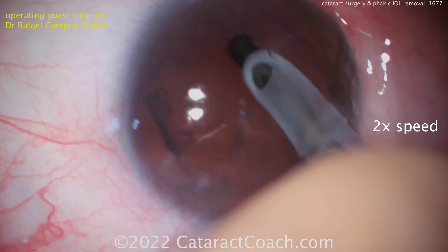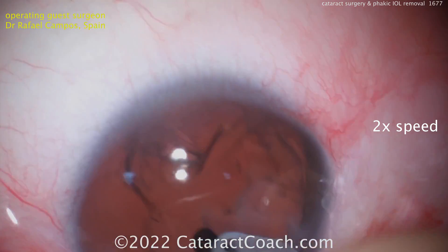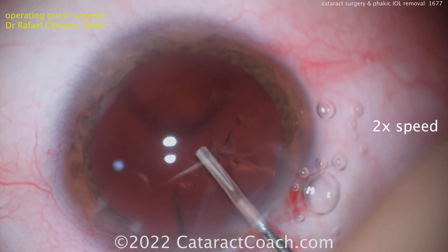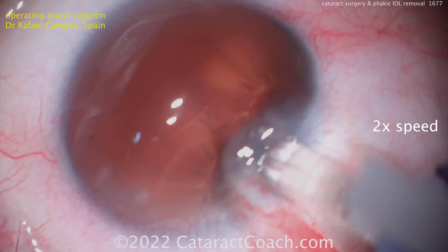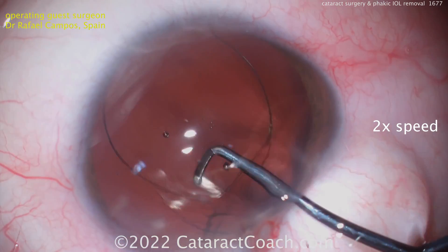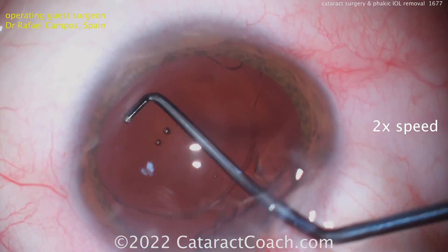Taking out the cortex. You can see by looking at this eye a big white-to-white measurement, and almost a reverse pupillary block — that's LIDRS: Lens-Iris Diaphragm Retropulsion Syndrome — deepening of the AC, because the iris is pushed up against the lens capsule. More viscoelastic going inside the eye now. Some sub-incisional material — manual irrigation can help get that out, or put the lens in first. Here's our lens: looks like a single-piece acrylic monofocal lens. Get that in the capsular bag, get it rotated, and now the surgeon is using that lens to help loosen up that sub-incisional cortical material.